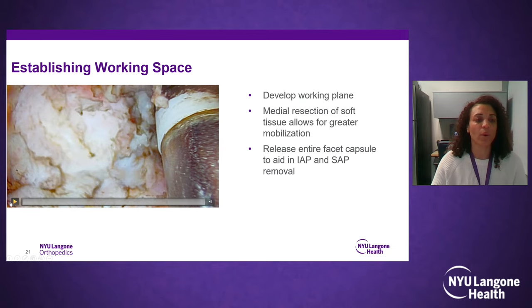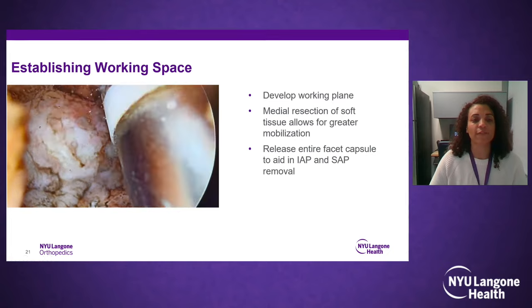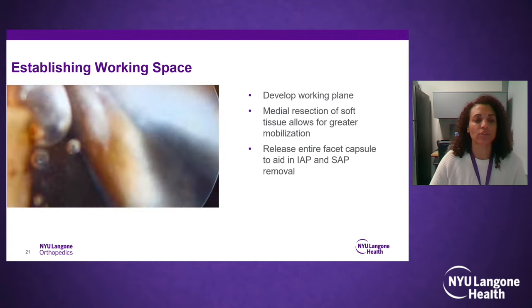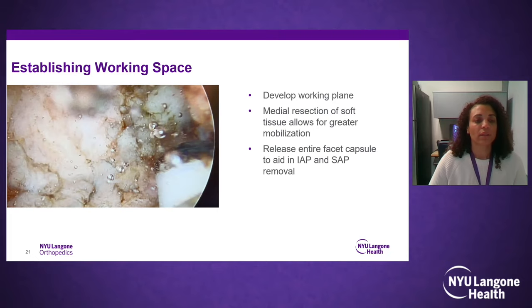And then here's a video of establishing the working space. This can take a fair amount of time at first because you want to make sure that you are over the right level. You understand where your lamina is, where your facet joint is, where your capsule is. And then it can take a while to fully release the entire facet capsule.